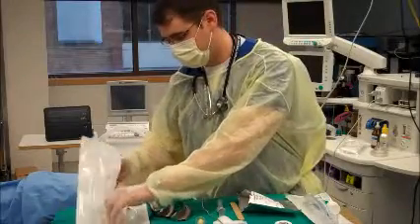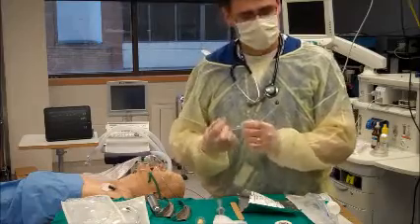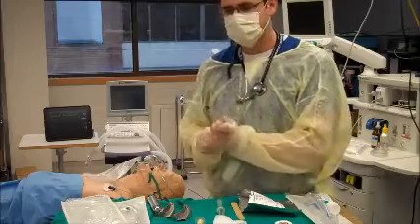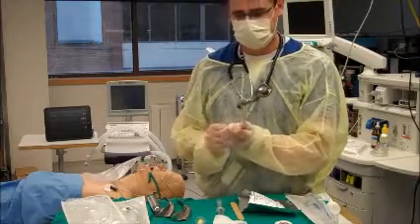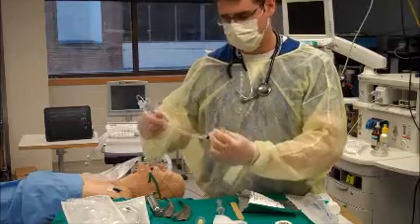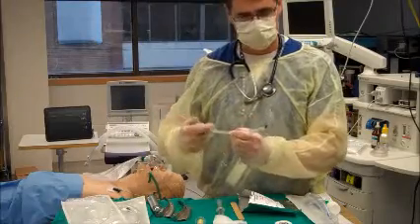I'll choose my tube that's going to be pre-tested, then insert my stylet. I don't want to see the stylet come out the distal tip of the tube — I never want that to be the leading edge, so I want it hidden back behind the tip of the tube. I'm going to put a bit of an anterior curve on this, what we call the hockey stick curve, then lock down the stylet.